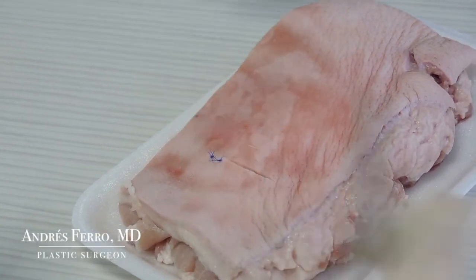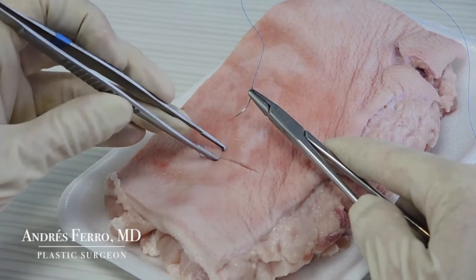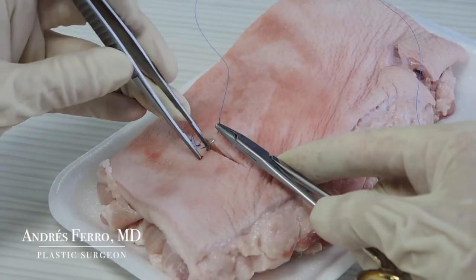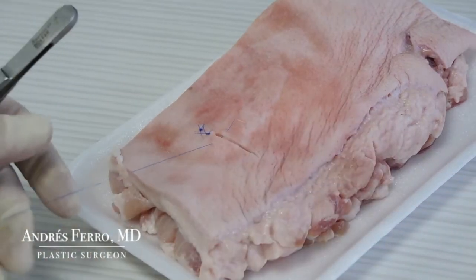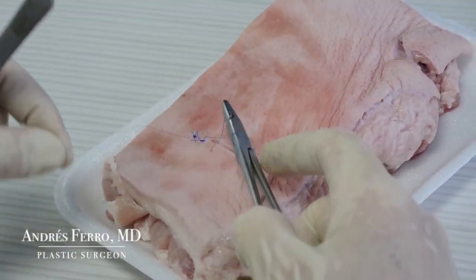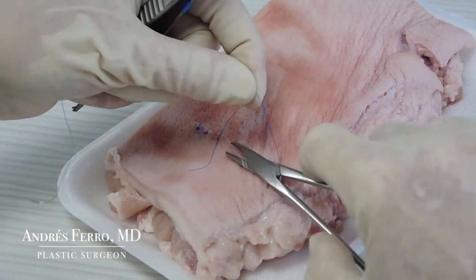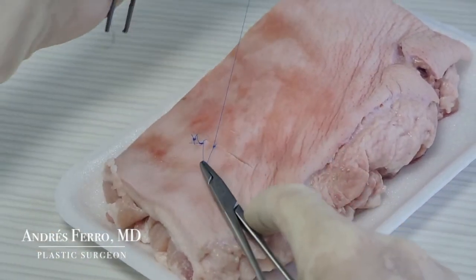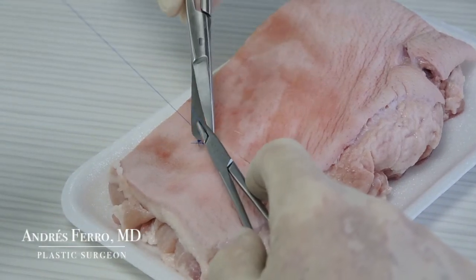To place the third stitch, observe the distance that you kept between the first and second one, and at the same distance make the third stitch — we're going to do it in a single stage. Pass the needle through the first side of the wound, and then the second side. Take the needle and do the knotting of the suture in the same way as previously. At the end of this knot, continue to place stitches until the wound is completely closed.